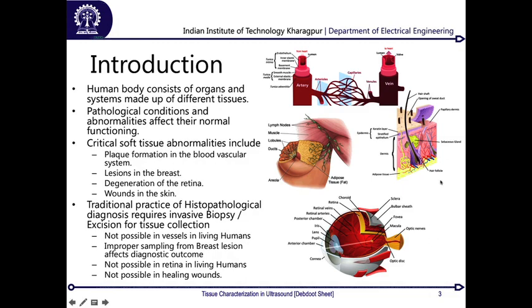And similarly for wounds, we would generally like to investigate clinically whether the wound is healing, and that means checking whether each of the multiple layers of skin is growing in a perfect way. The problem is, say this is the skin and I want to look into these layers, I am going to chunk out a part of tissue over there. So to understand whether a wound is healing, I am going to inflict another wound and pull out the tissue. So these are the major technical challenges why you can sometimes not use biopsy within a clinical environment.